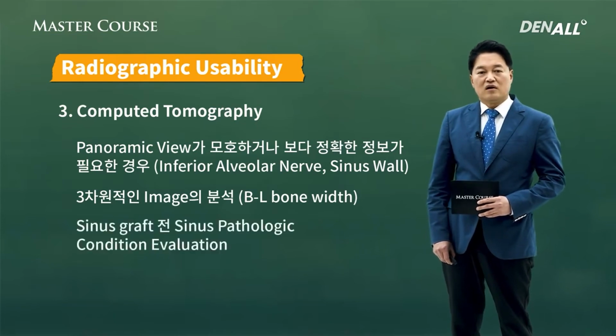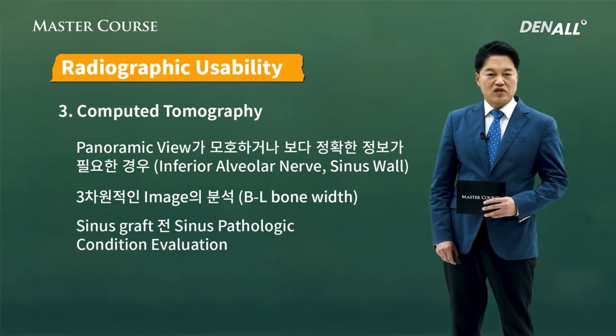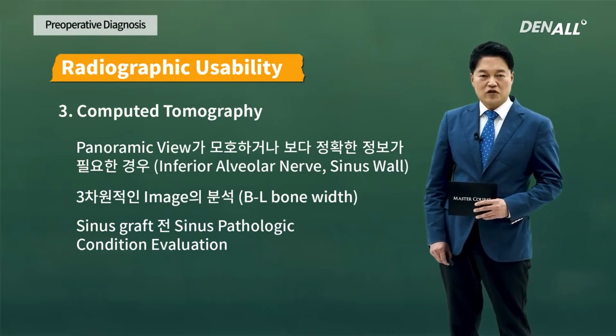Sinus surgery where bone graft is necessary. Before that, you need to evaluate the sinus pathologic condition. So CT needs to be taken to have a successful sinus surgery.